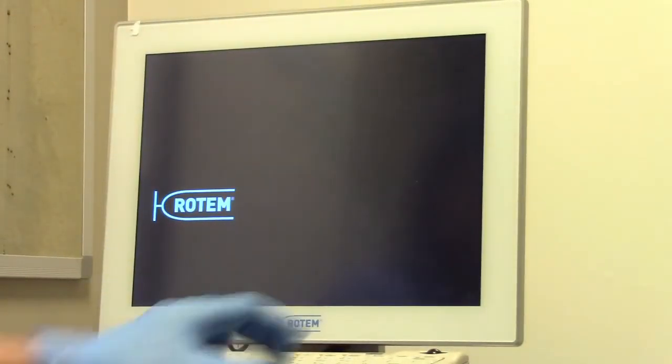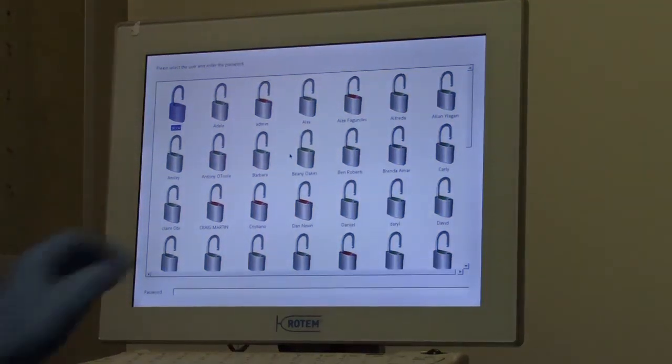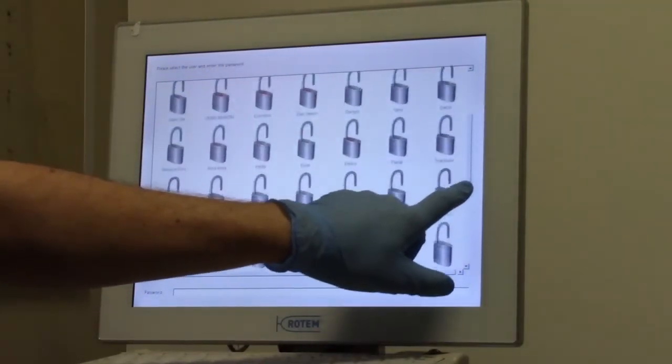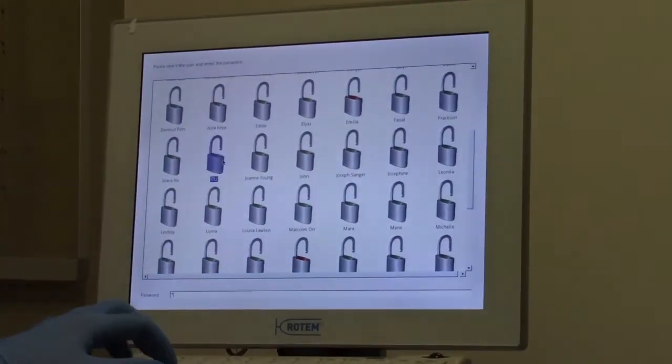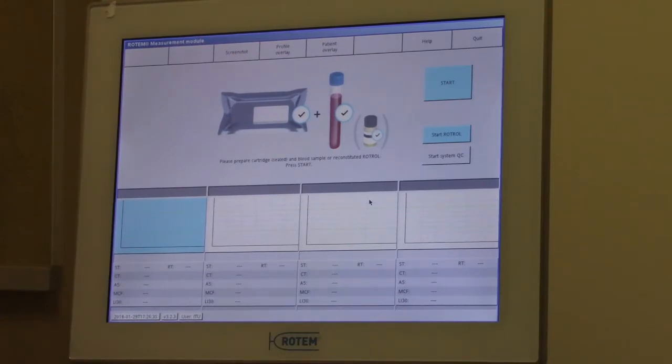Log in to the analyzer using your designated login profile. Now we will follow the instructions displayed on the screen to start the test.